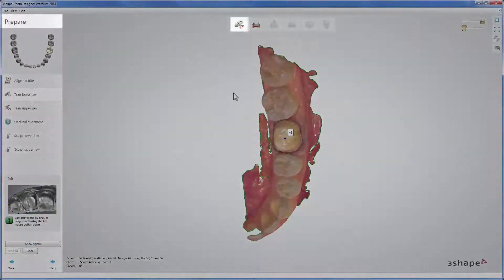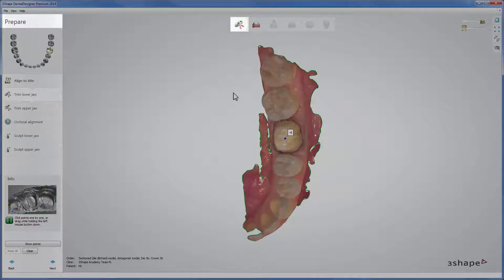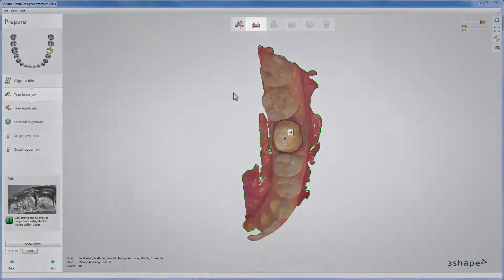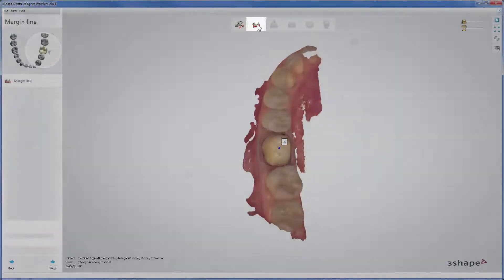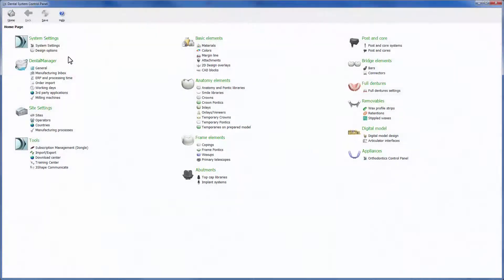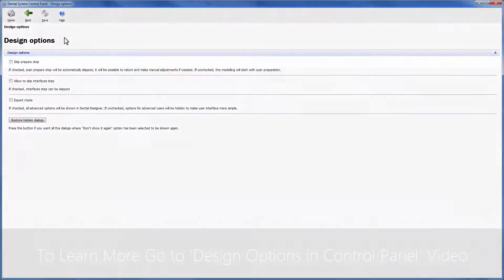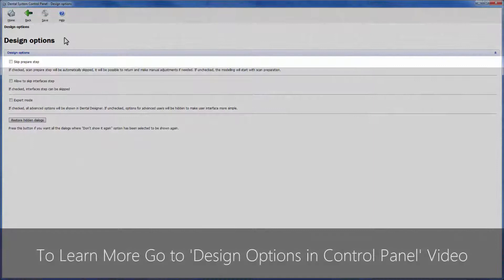When the case opens, you are at the stage called Prepare. This stage can be skipped if preparation is not necessary by going straight to the margin line step in the workflow bar. You can also change settings in the control panel so that the prepare step is skipped by default.